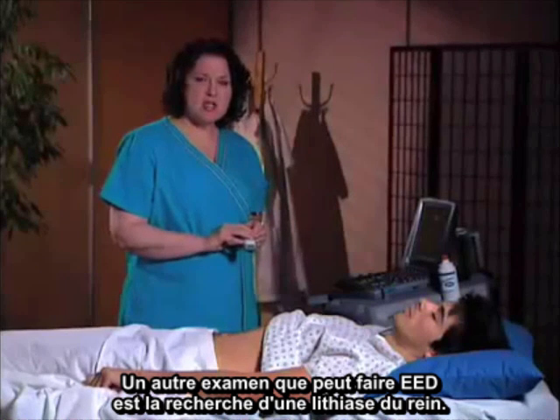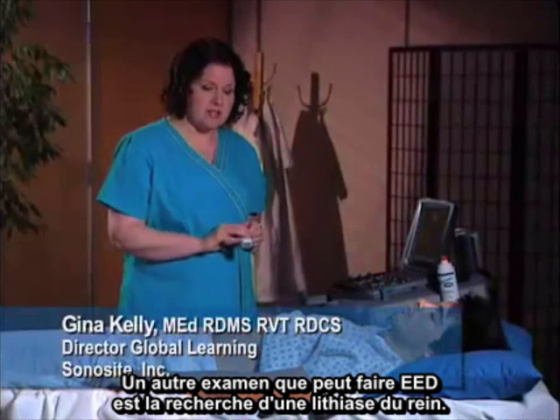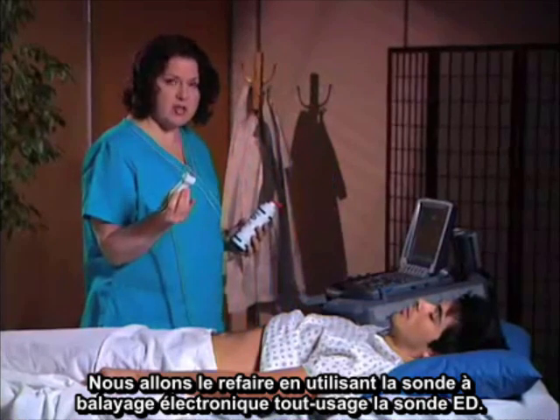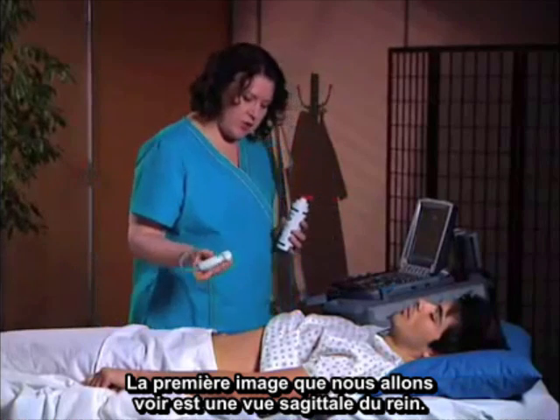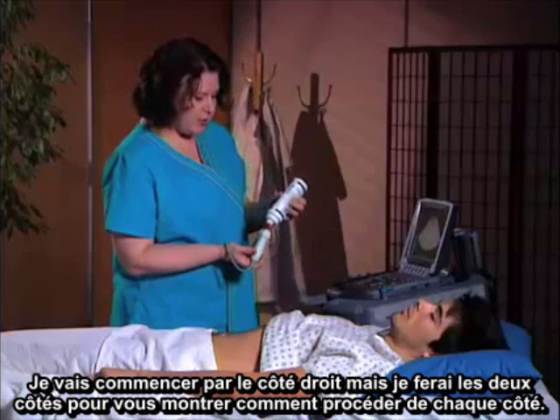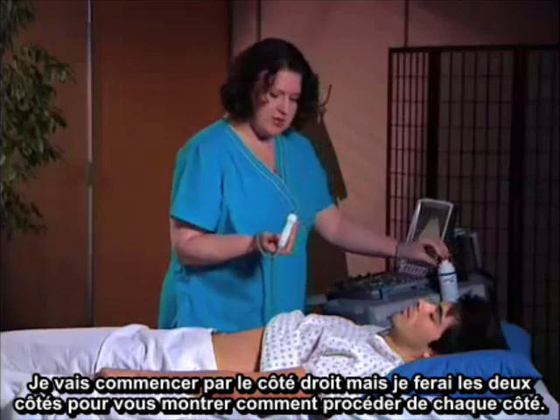Another examination you can do in the ED is the evaluation of the kidney for nephrolithiasis. This is a relatively easy examination to do. We're going to use, again, the phased array transducer, your all-purpose ED transducer. The first view that we're going to look at is a sagittal view of the kidney. I'm going to start on the right side, but I will do both sides to show you how to do an evaluation on both sides.